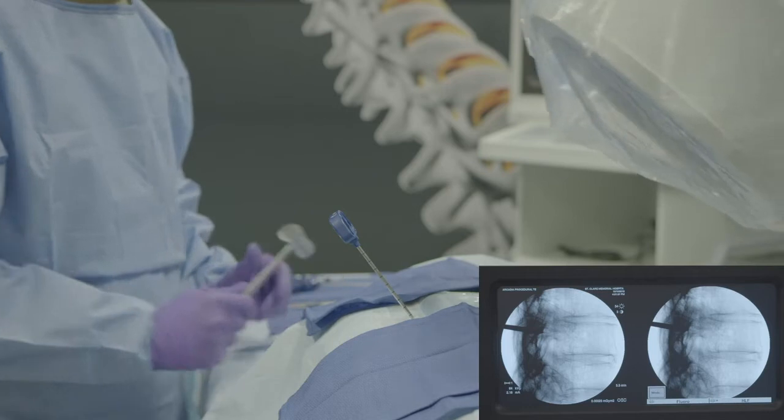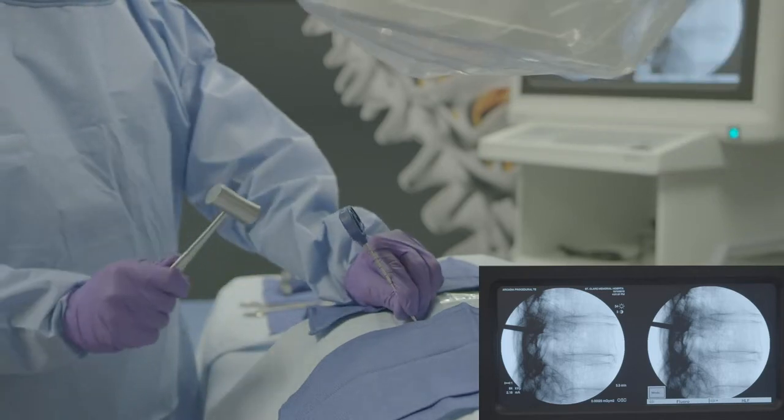In the AP view, advance the access introducer to mid-pedicle.